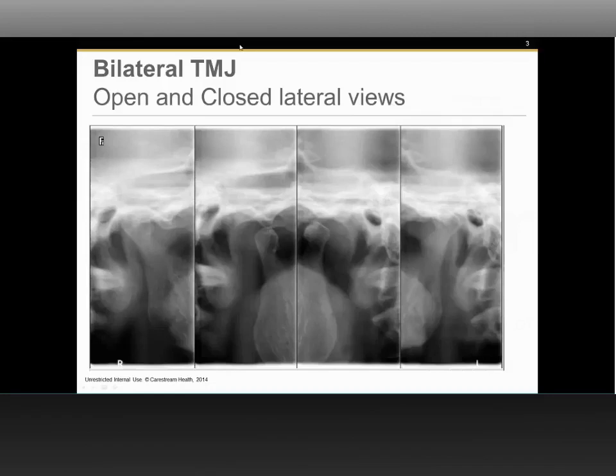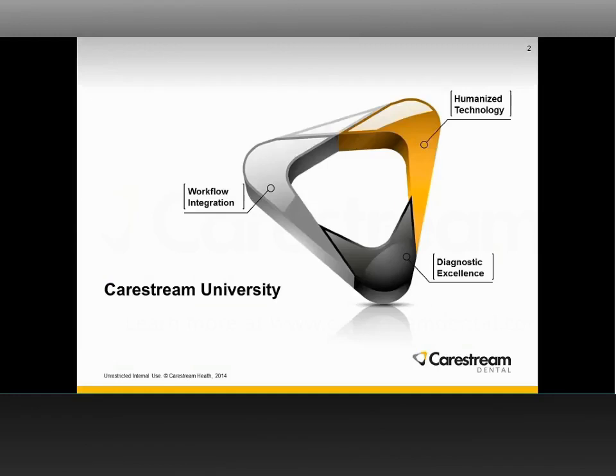So what are the indications for use of CBCT imaging in visualizing the TMJ? Well, it is very simple. As I've noted before, CBCTs can be used for or applicable in any kind of hard tissue imaging. So anytime a clinician suspects some sort of osteoarthritic changes or any change in hard tissues, if you suspect that there could be possible changes in the hard tissues of the TMJ apparatus, a CBCT scan is very well warranted.